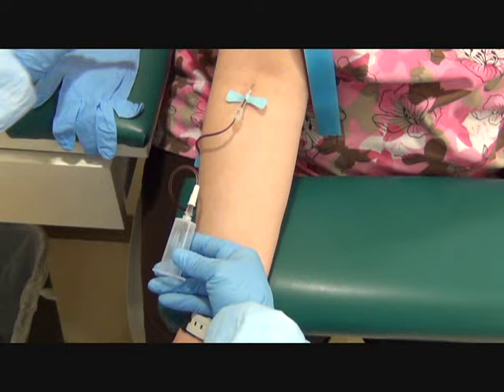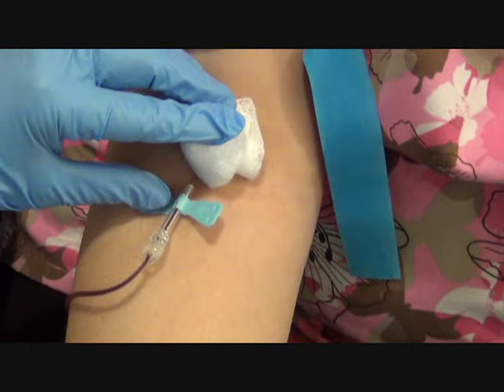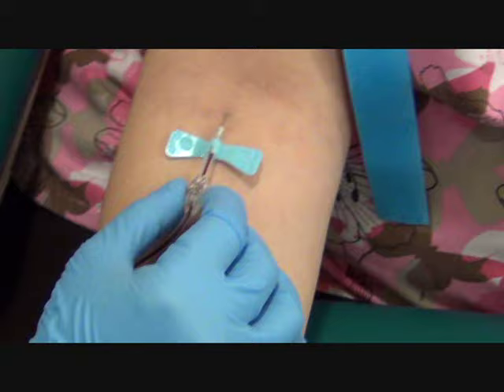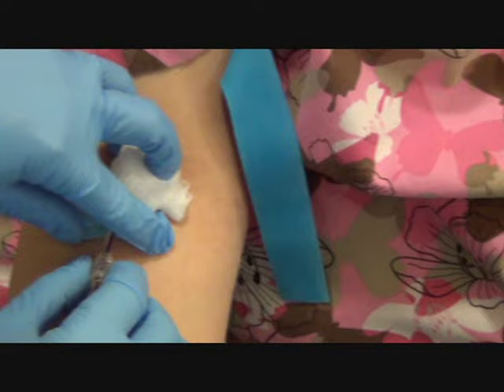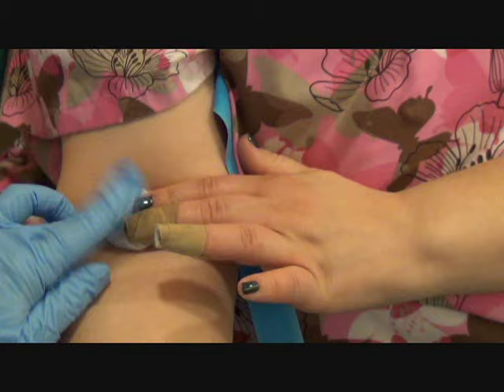As I stated before, this needle will be activated in the patient's arm. I'm going to get my gauze and place it over the needle without pushing down. Before that, I want to grab the base and let go of the hub. I put my gauze over it without pushing on the needle, push down on the wings, squeeze the base, and pull back fast until I hear a click. Push down on the patient's arm and apply pressure. The needle is already activated and I discard it.